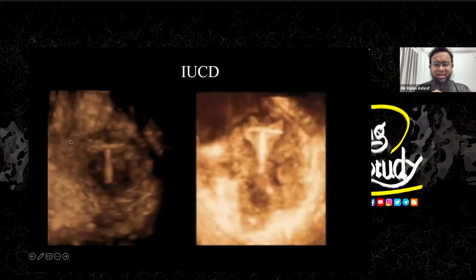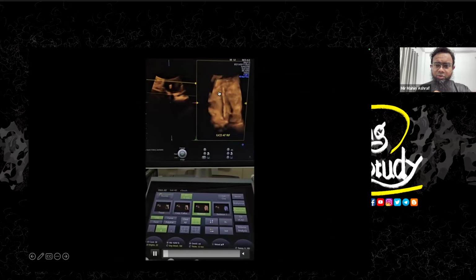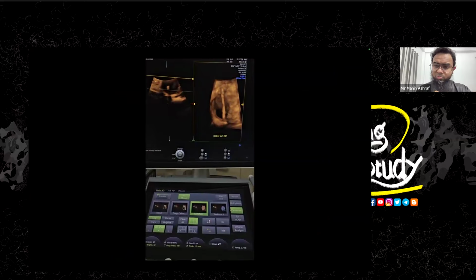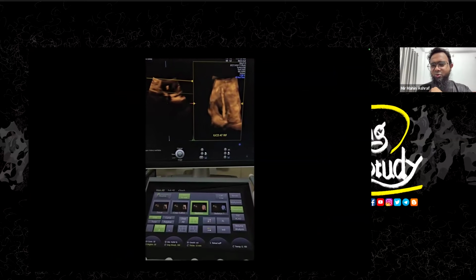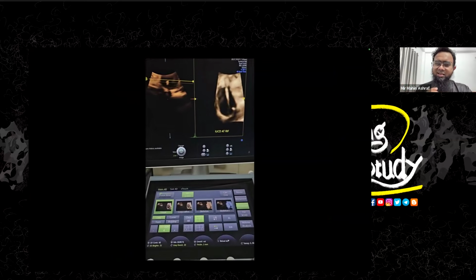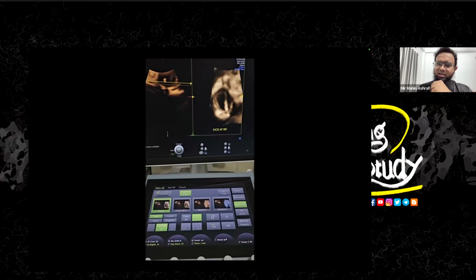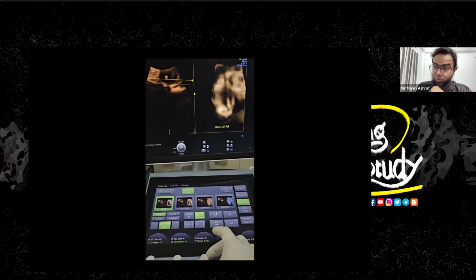We can also show you the intrauterine contraceptive device like IUCD. Commonly in my country, copper T is used. So here's a picture of the copper T, which was found in the right iliac fossa. So it was displaced, not only displaced, it was perforated. Interestingly, this patient has gone through a hysterectomy for, I don't know for what purpose, but this intrauterine contraceptive device, which was displaced or perforated and located in the right iliac fossa, was not removed.